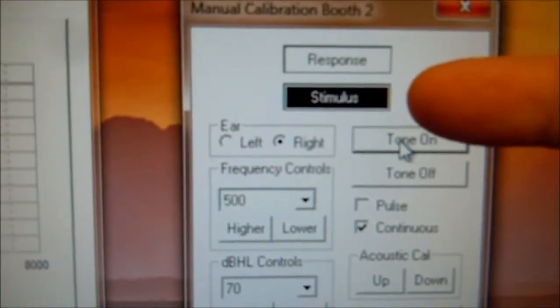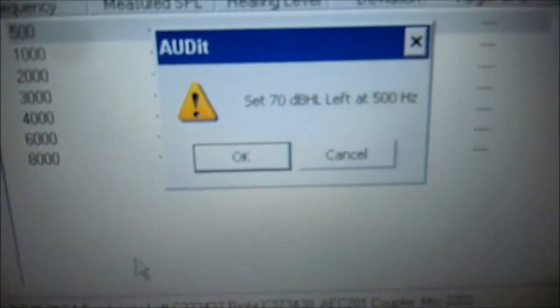Right now it's emitting a tone and we see the stimulus. Come back here and we press OK.